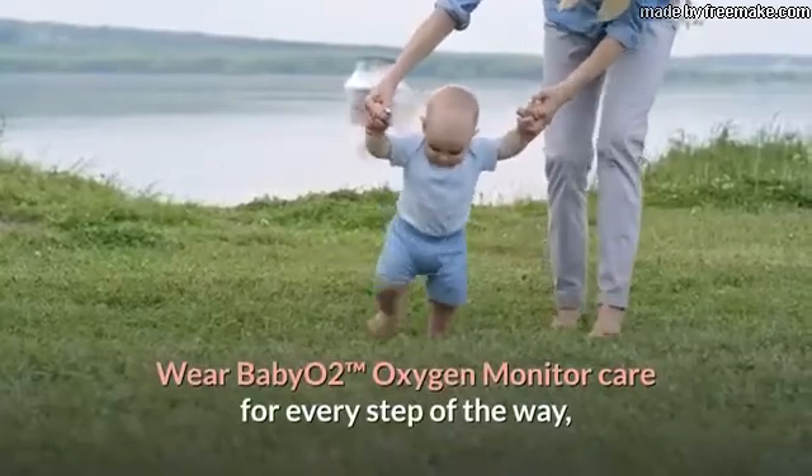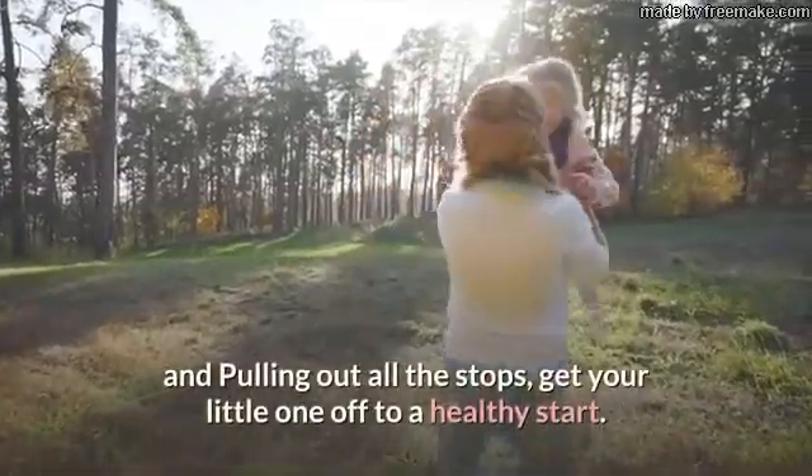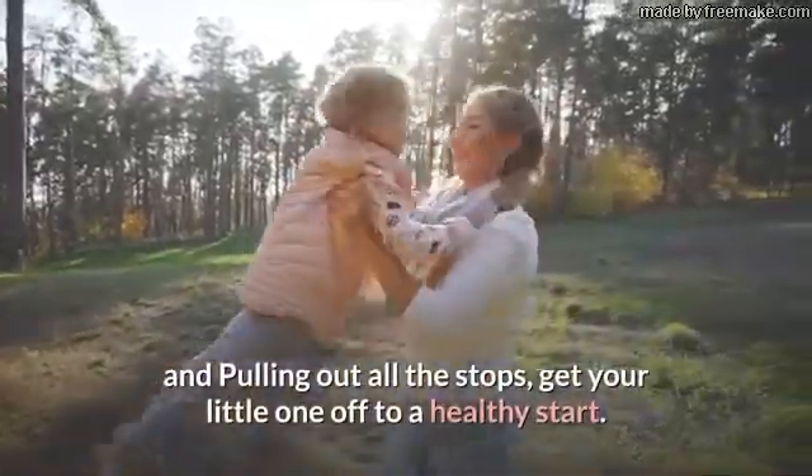Wear Baby O2 Trademark Oxygen Monitor — care for every step of the way, pulling out all the stops to get your little one off to a healthy start.